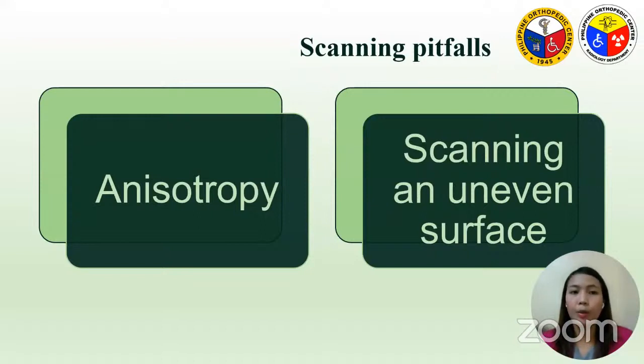Improper patient positioning can have an impact on image acquisition and quality. It is critical to place the patient in a comfortable and ideal position that allows proper access to the shoulder and adjacent tissues.